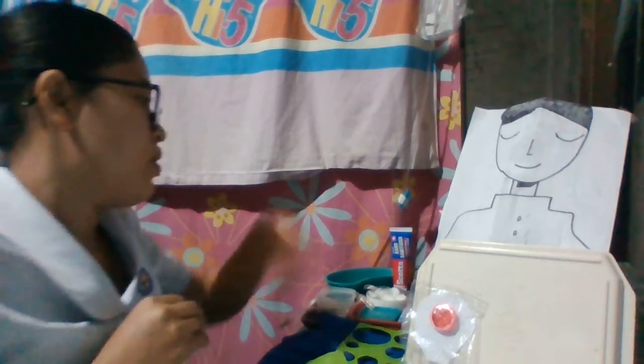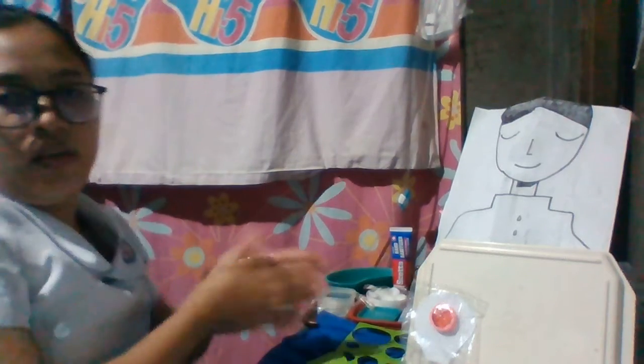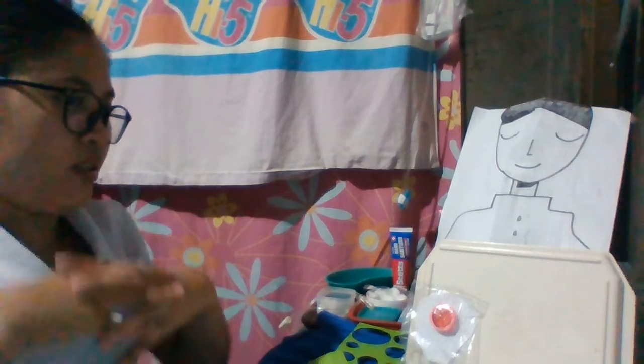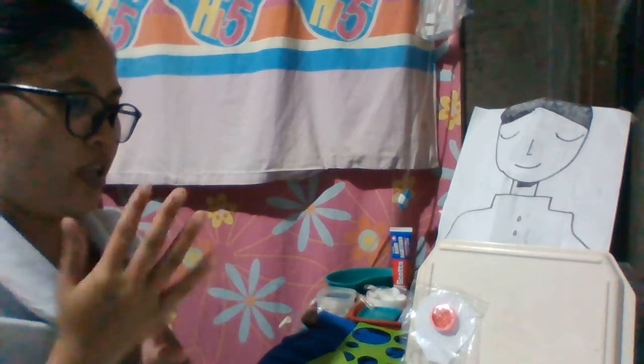Then for evaluation, we need to note the appearance of the stoma, the surrounding skin, and the incision if present, while the pouch is removed and skin is cleansed. Report any deviation from normal findings to the physician.